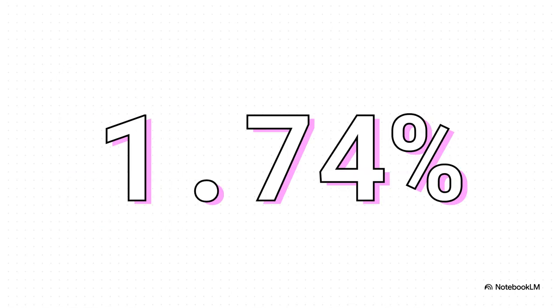So the test has low sensitivity. But what about the flip side? Specificity. Well, it's actually highly specific, but, and you knew there was a but coming, it's not perfect. A really big study found that about 1.74% of people with zero history of seizures will still have IEDs on their EEG. It's a small number, but it's a critical reminder that finding an IED does not automatically equal a diagnosis of epilepsy if the patient's story doesn't fit.